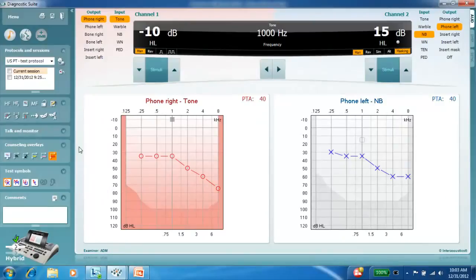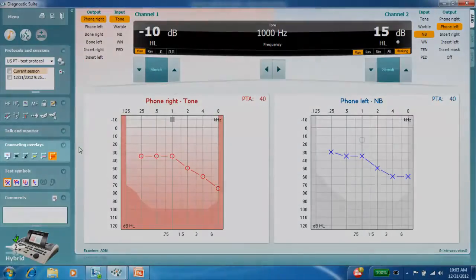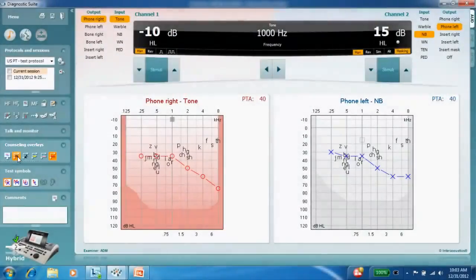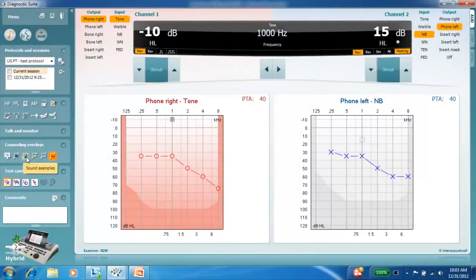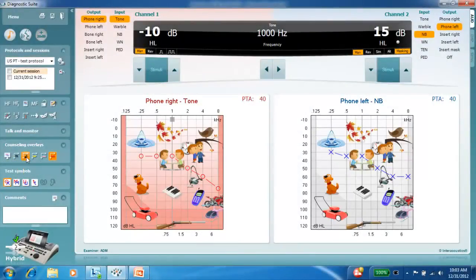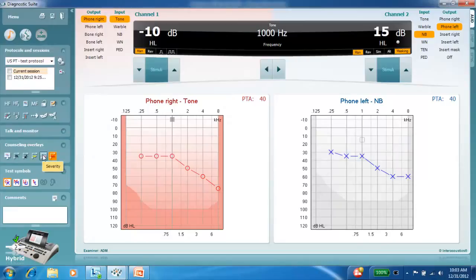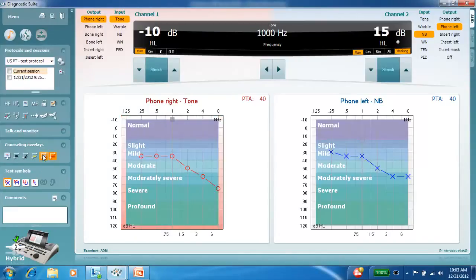Additional counseling overlays have been added for improved user interface. The overlays available include phoneme examples, sound examples, speech banana, and severity indicators.